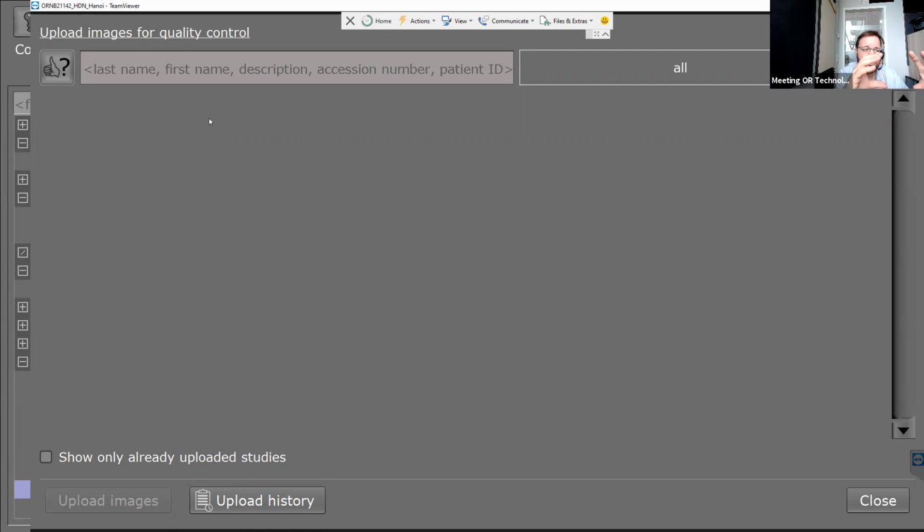So we can use the images you send us here to analyze the images. Is this function always available, even if there is no internet connection? No, you need internet connection.